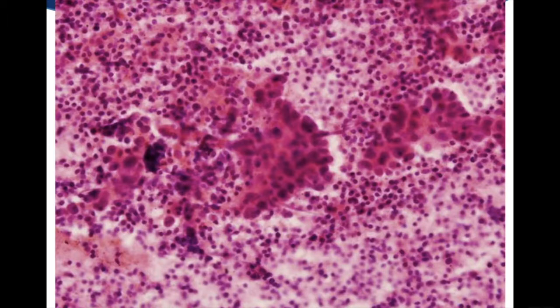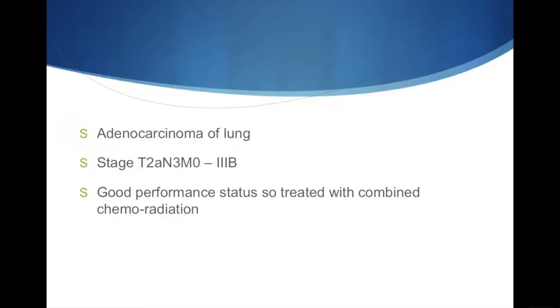Here is an example of the on-site cytology. You can see some lymphocytes in the background which are normal, but in the middle and over here are clumps of large abnormal cells with pleomorphic nuclei that look clearly malignant. So we know we're in a lymph node and we've aspirated malignant cells. This turned out to be adenocarcinoma of the lung, T2a, and given that the mediastinal lymph node on the right side was abnormal, that means there's a contralateral mediastinal lymph node metastasis staging it as N3. This patient was treated with combination chemo-radiation with curative intent.